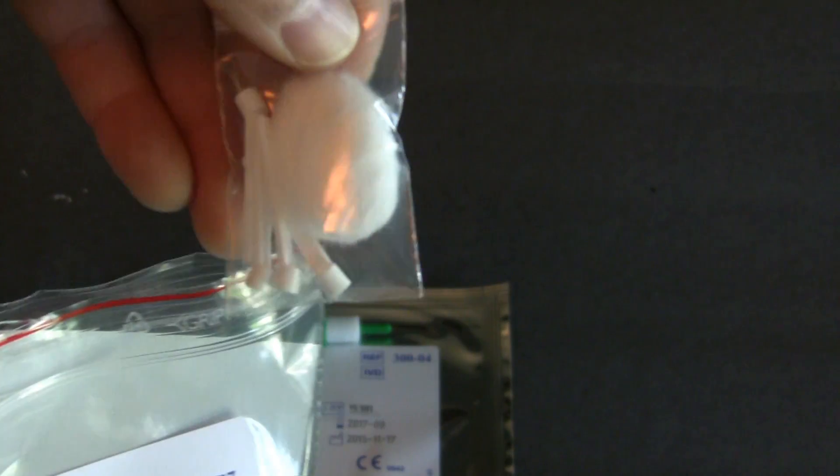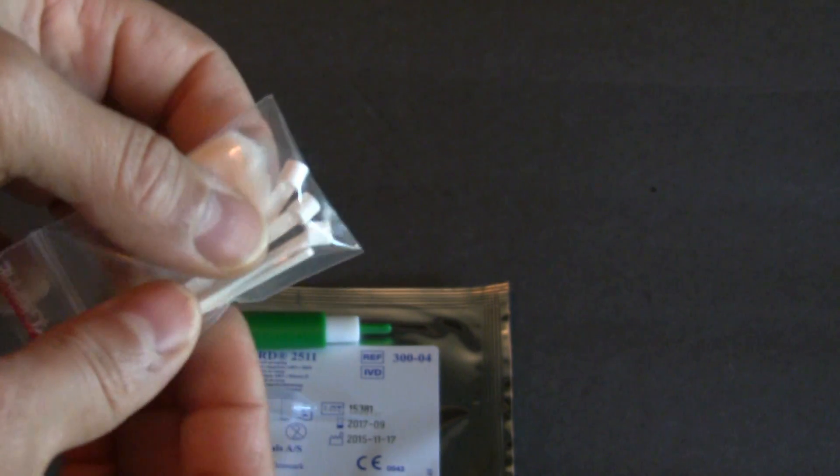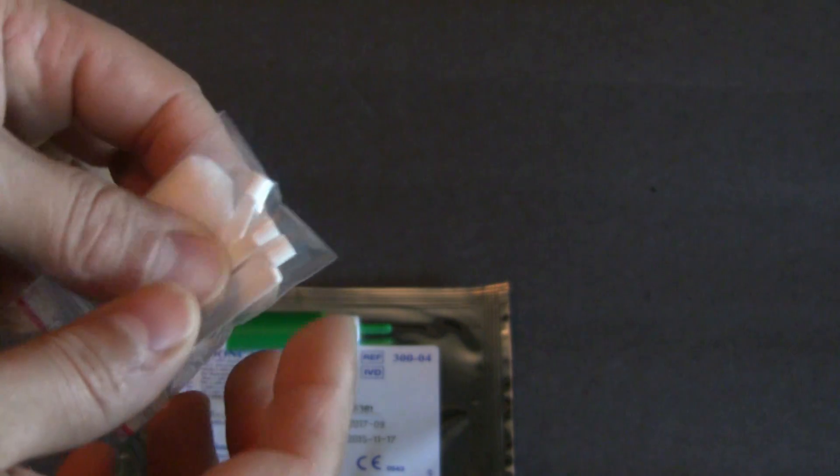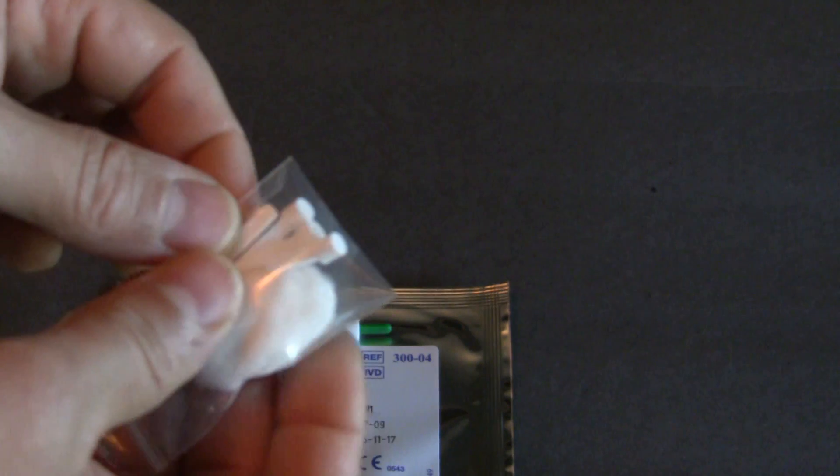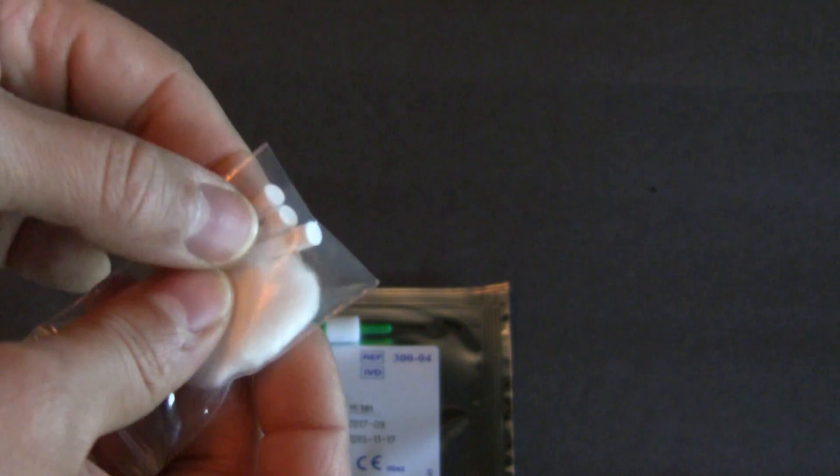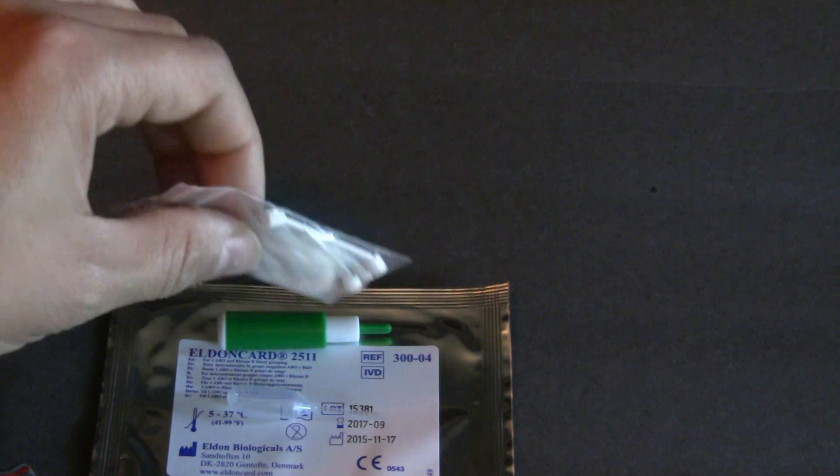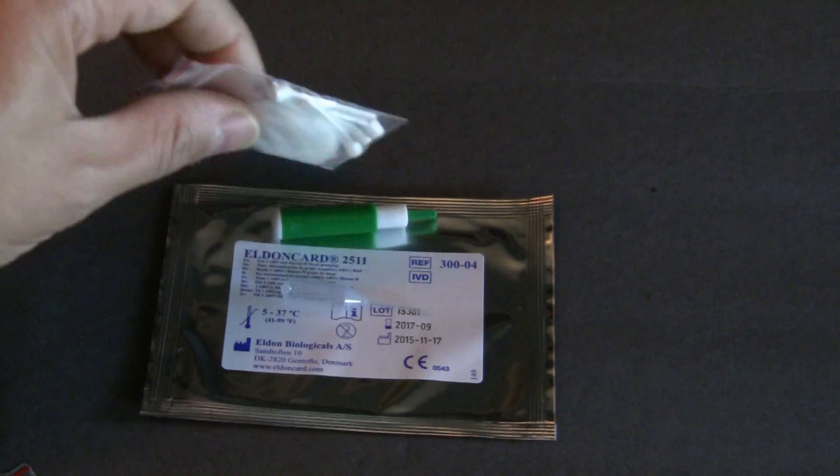Comes with a cotton swab and four Eldon sticks. So the deal with these Eldon sticks is you're going to put the blood, once you prick your ear or your finger, you're going to put the blood on top of the Eldon stick and you're going to lay that down on the Eldon card.